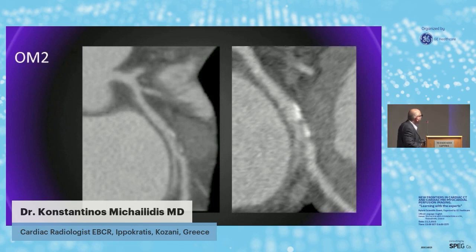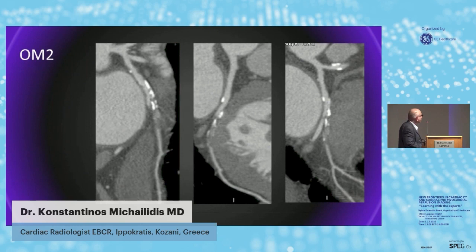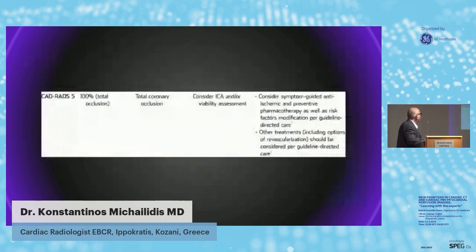In 2009, he had this plaque that is a quite unstable plaque, which seemed to stabilize in 2013. It's mostly calcified. In 2020, it was occluded. He had some short segment chronic total occlusion of the second obtuse marginal branch, which was quite large, although the patient was on statin treatment but never quit smoking.